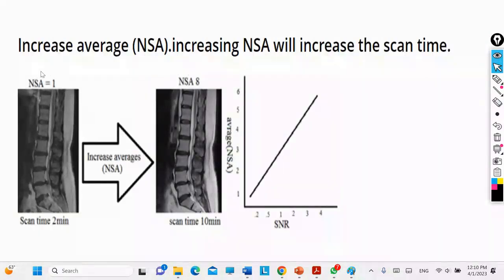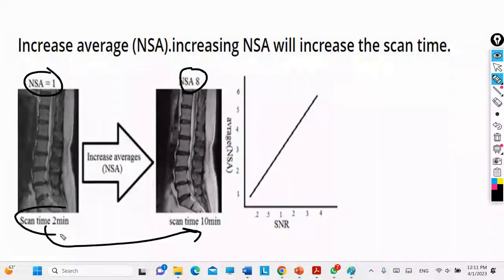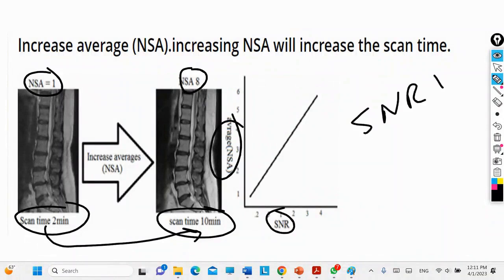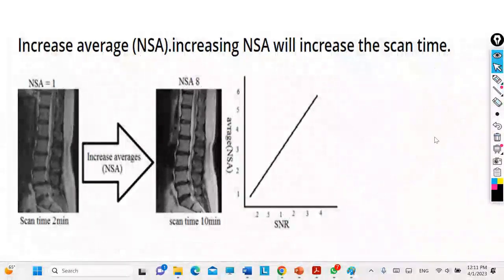Here you have the number of excitations set to one, and here it is set to eight. Based on image quality, the one with eight excitations is clearly better. However, the scan time increases significantly — for example, from two minutes to a much longer duration. Increasing NEX will make the image overall smoother, but it will come at the cost of scan time.